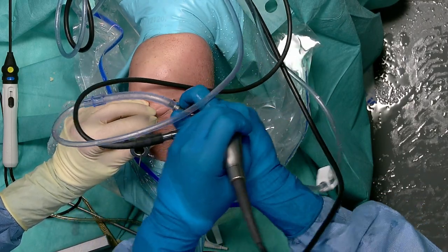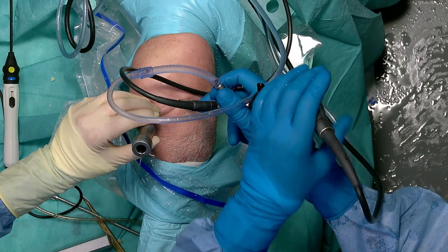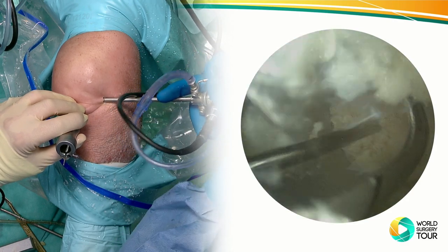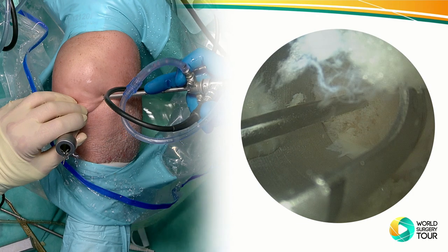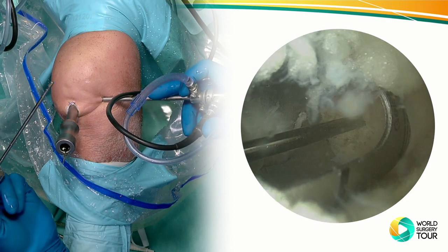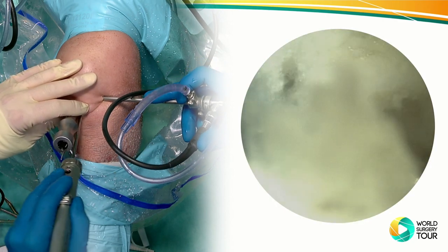Again, first I want to visualize before I remove all the fluid. Okay, see. Here we go. There's a window. So now we close it again. Need to bring in the shaver to remove the fluid. We just want to take off the little bit of the fat tissue here. Still, when we bring it in, I really would like to have an unobstructed view.